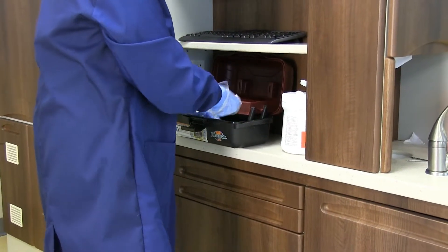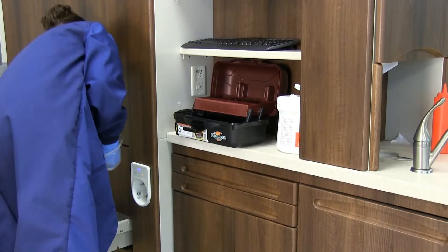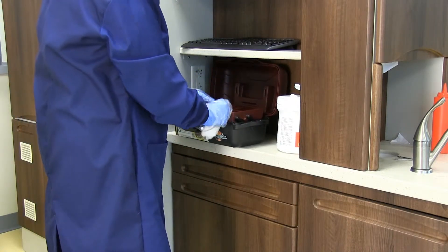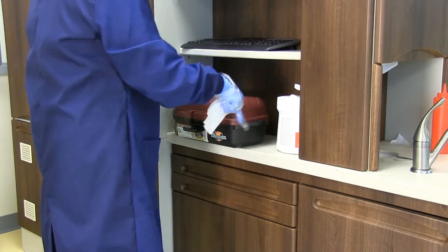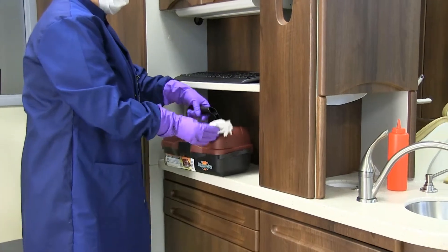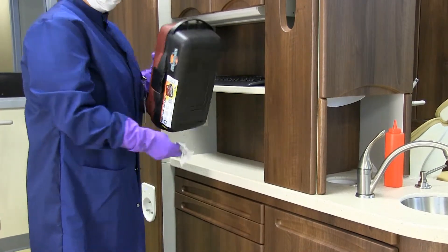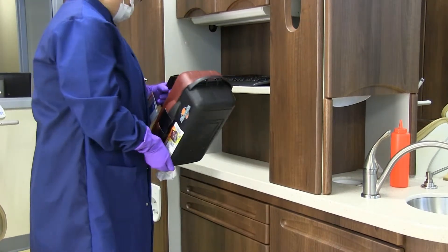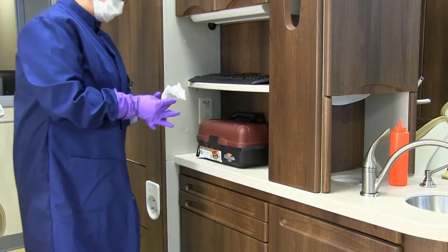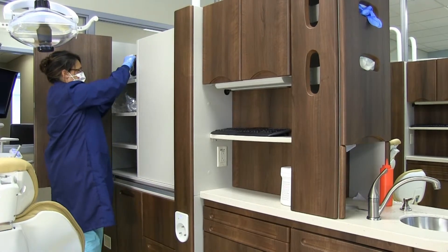Wipe the hand mirror and place it on the side counter. Wipe down the disclosing solution, patient education materials, and patient and student protective eyewear. Then close your tackle box, wipe the outside sides and bottom of the tackle box, and put the tackle box away inside the cabinet.